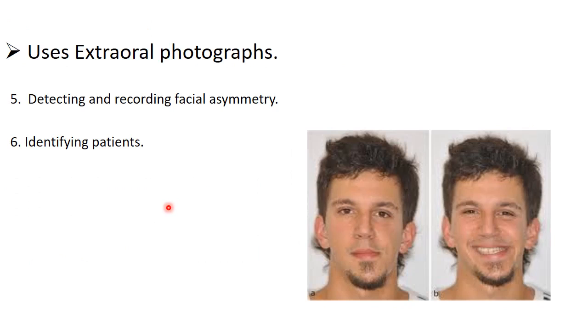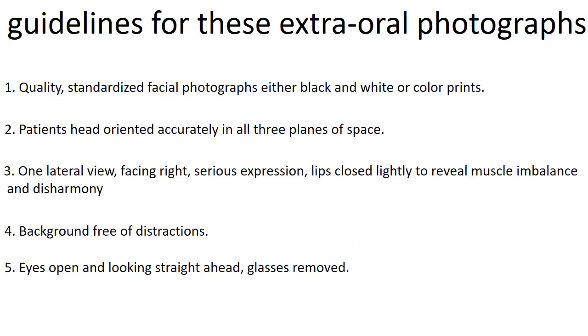Also, extraoral photographs can be used for detecting and recording facial asymmetry. It can be seen here that this patient has facial asymmetry, and at the end it's a way of identifying the patient. So you can know who is the patient for each case. So this is an extraoral photograph.